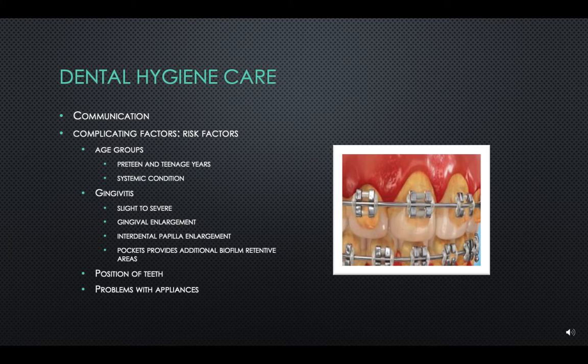Problems with appliances. Orthodontic appliances retain biofilm and debris. Accidents may cause a bracket to become detached.